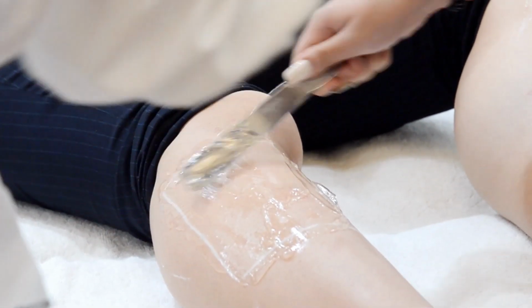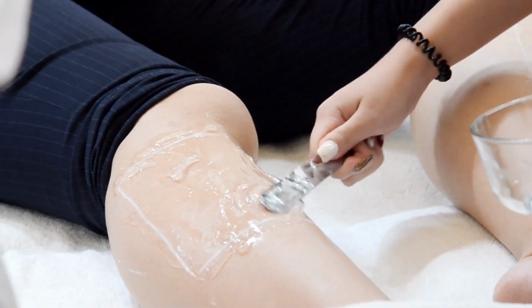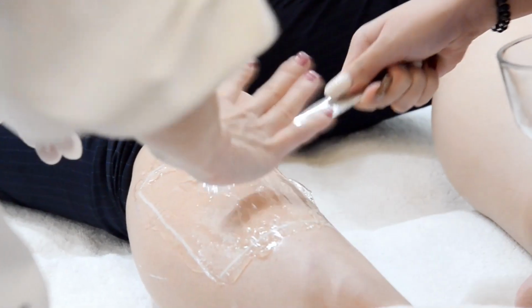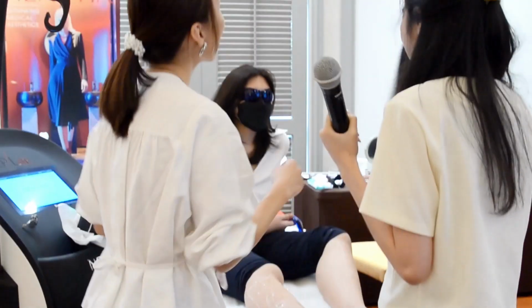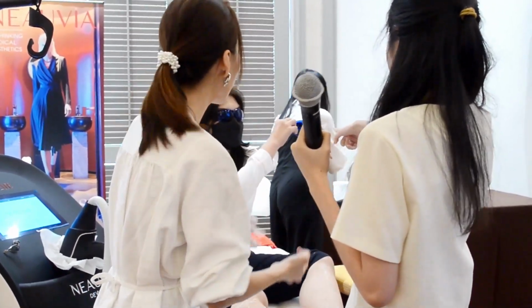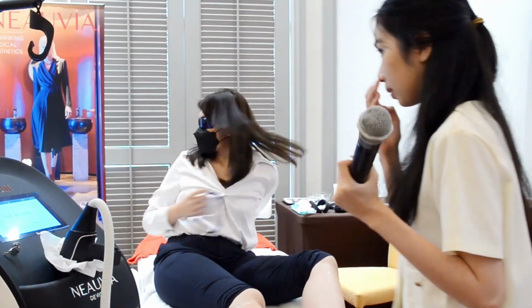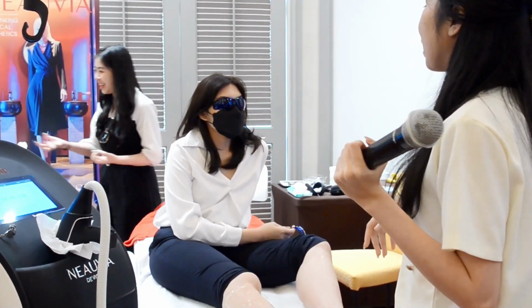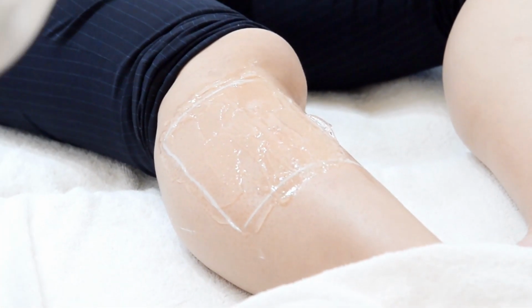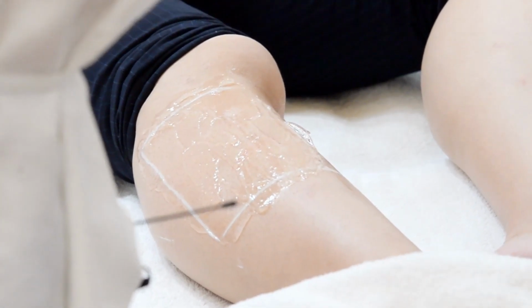So if you're ready, then we can set the parameters. It's enough already, too much already. It's enough, no need so much. Okay, can you put on your gloves? I'll ask her to put on gloves. So during demonstration in the clinic, do put on your gloves.